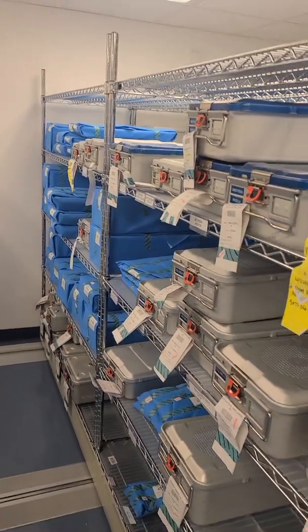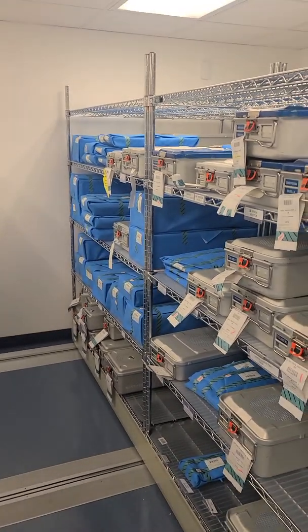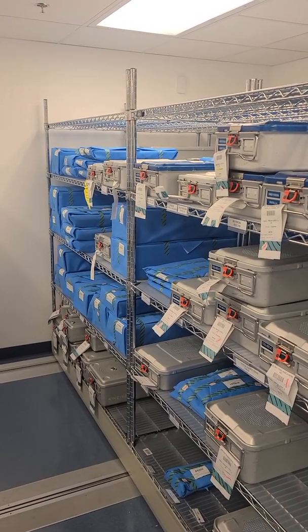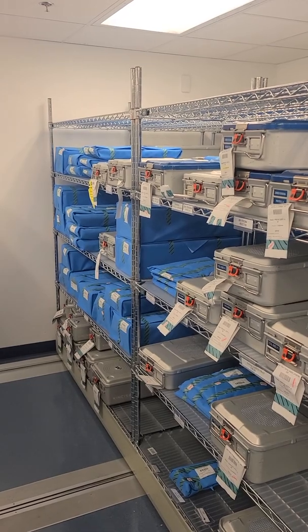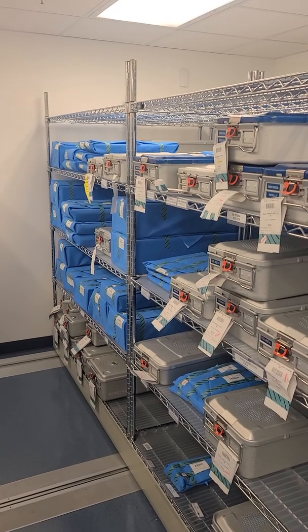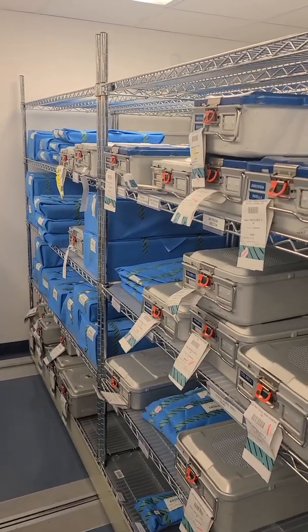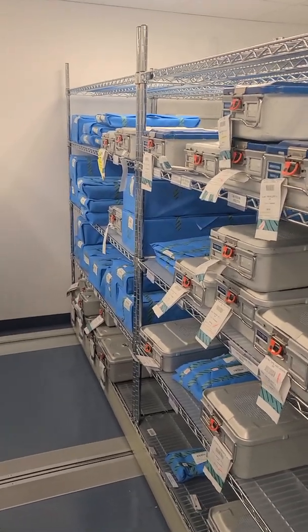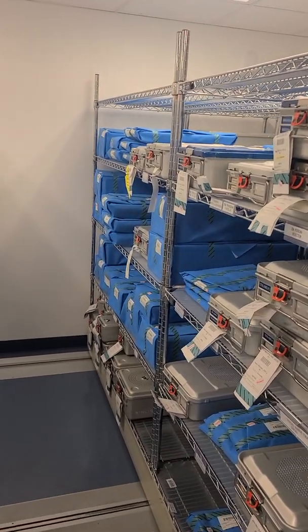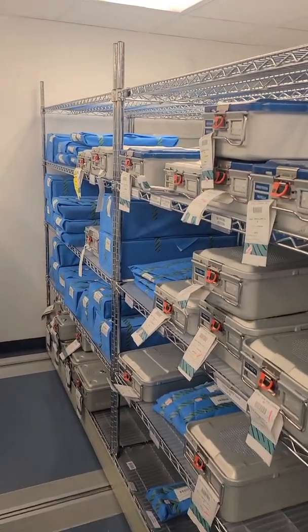So storage — what does AAMI say? In Section 11, AAMI addresses storage and transportation of sterile items. It basically says it should be in an environmentally controlled environment that is easily accessible and cleanable. In a nutshell, it should be low traffic. It tells you about the shelving recommendation — that it should be enclosed.